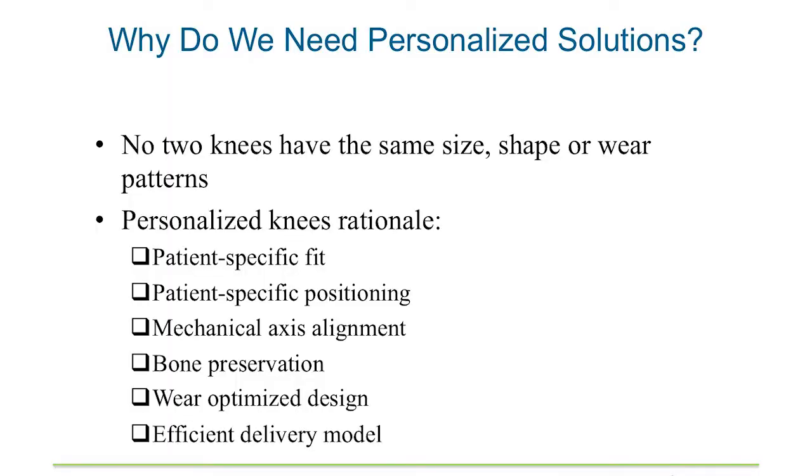So this company Conformis, and I should have declared at the beginning that I don't get any kickback from them, but they've come out with a system which we're going to talk about now, where a patient has their own custom-made implant. So it's a patient-specific fit, which allows us to position the implants specifically.